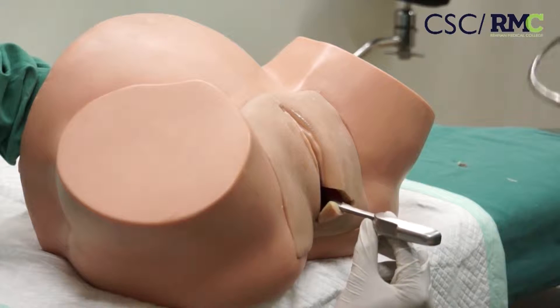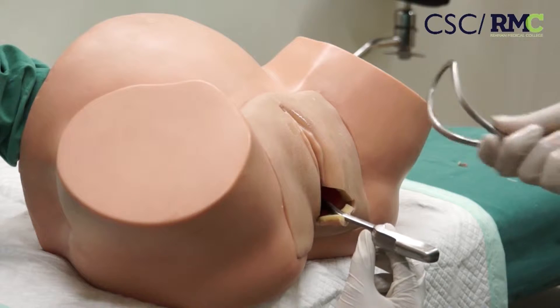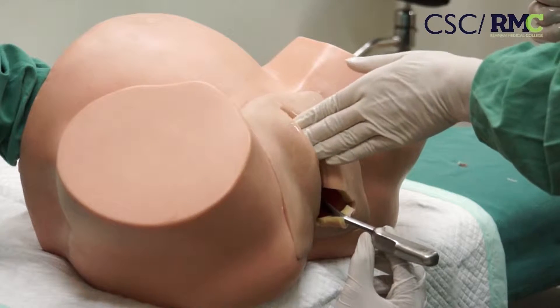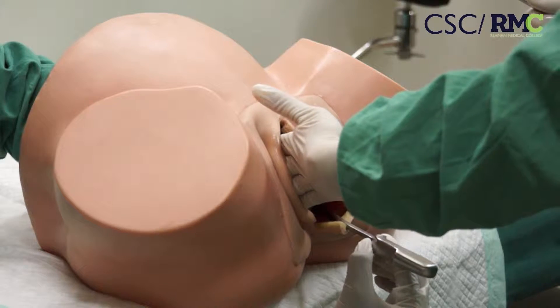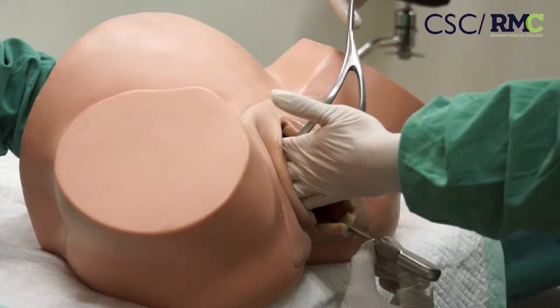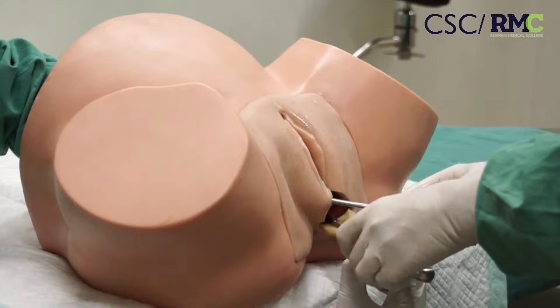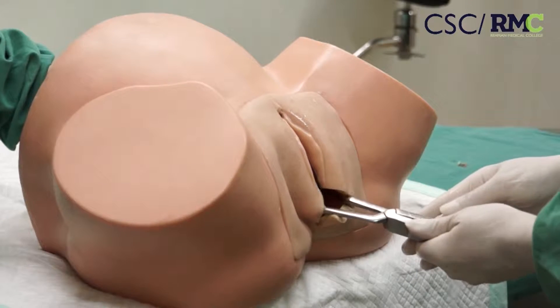Now take the right blade and lubricate it again. Pull your left hand between the fetal head and the maternal right lateral vaginal wall, and in the same way sweep this blade between your hand and the fetal head. After insertion of both blades, this blade must lock properly.